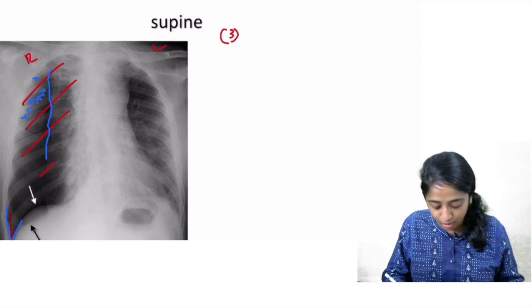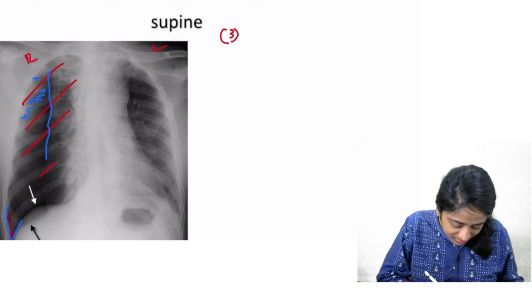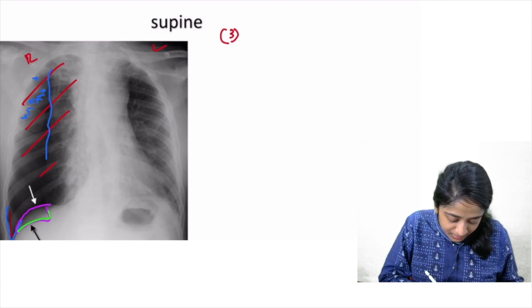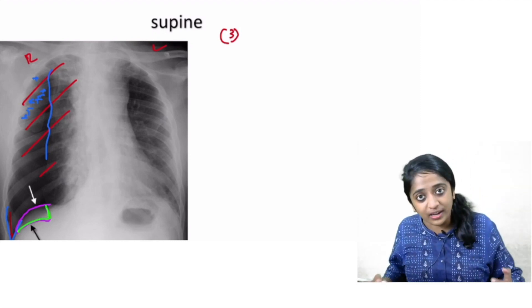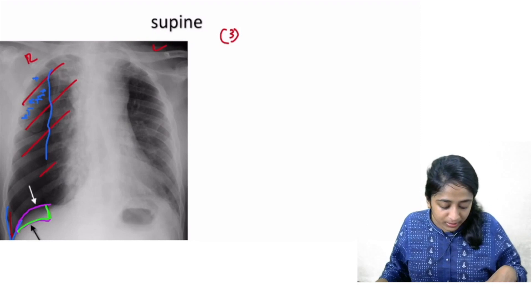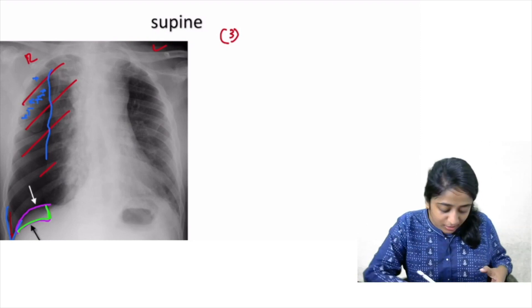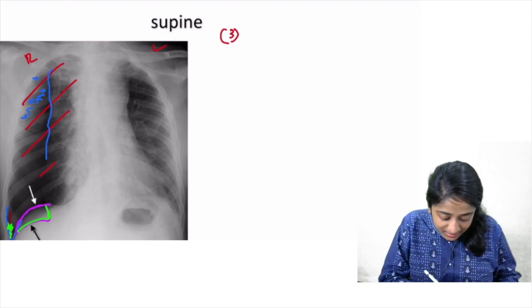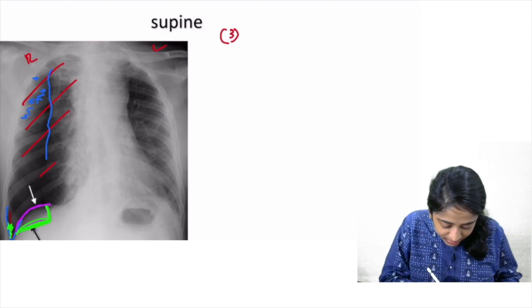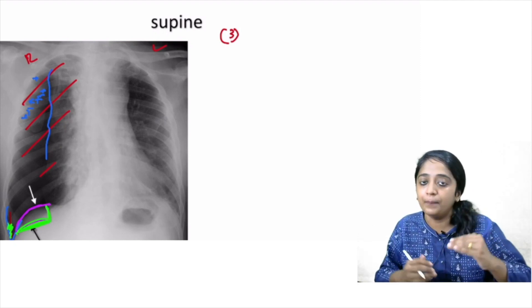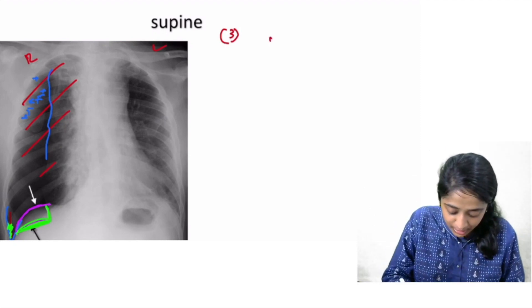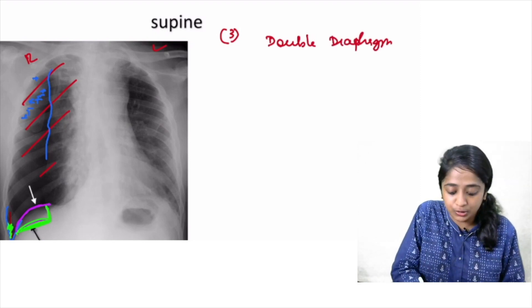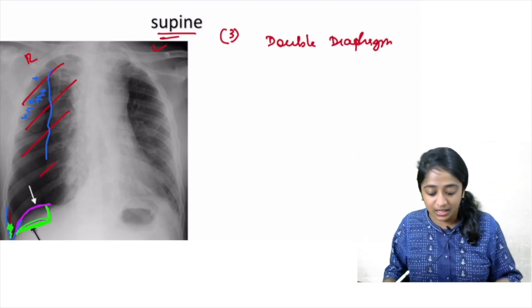And furthermore importantly, what do you see? I am seeing double diaphragmatic contour. This over here and one more lucency like this. Why is it so? There is air within the pleural cavity that is collecting in the costophrenic angle outlining the dome of the diaphragm as well as the anterior costophrenic recess. So that gives apparent double diaphragmatic contour. So double diaphragm sign is an important sign of pneumothorax on supine radiograph.